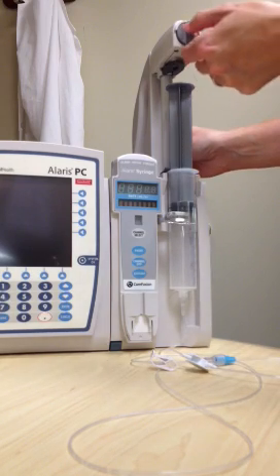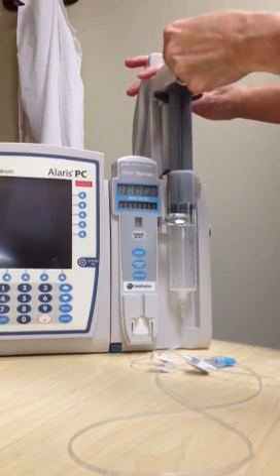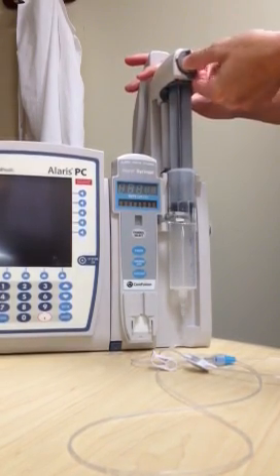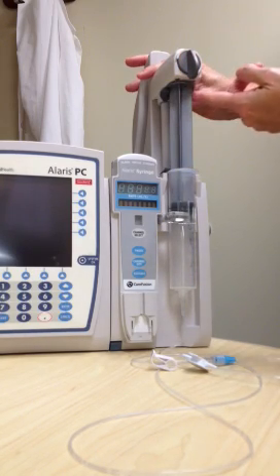Lower the drive head by twisting the grip or control, lowering it until it makes contact with the plunger and releasing the grip or control gently, being sure that the plunger is being held securely in place by the plunger grippers.